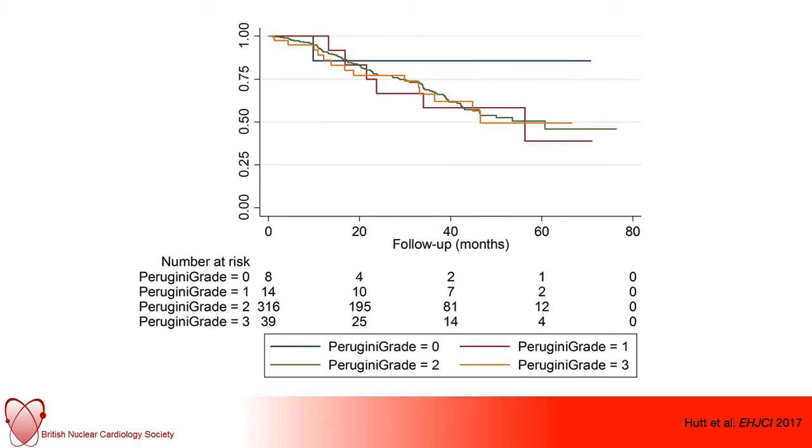30 months. And this perhaps shouldn't be wholly unsurprising, in that we are categorizing these patients very arbitrarily based on only 3 grades of positivity in what is a complex multi-system condition. And so perhaps this reflects the crudeness, if you like, of the scoring system rather than that it's not prognostically significant. So perhaps if we can quantify this myocardial uptake a little bit better, we will find that this becomes prognostically significant.